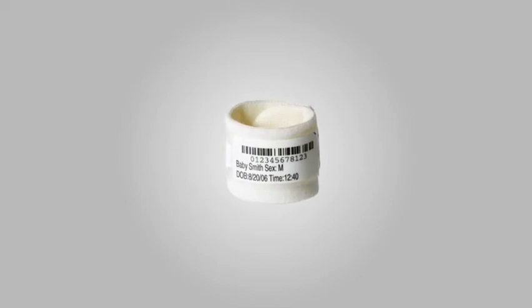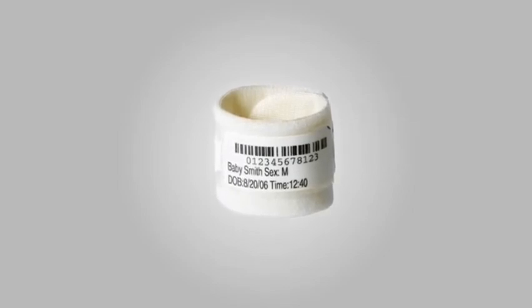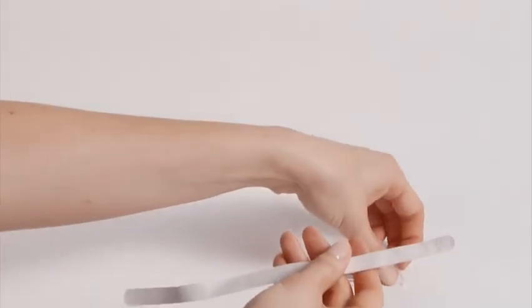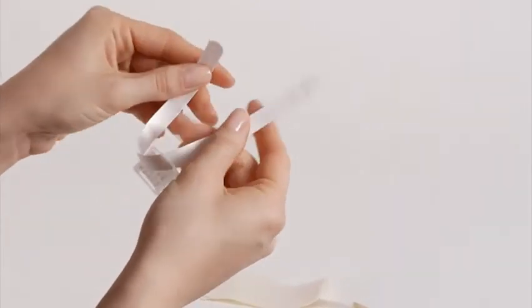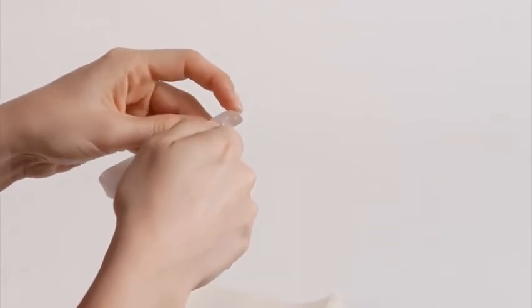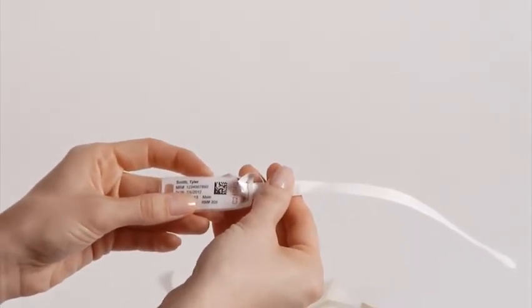Laserband's infant wristbanding solutions also include a second option using our Comfy Cuff, a soft foam cuff that adds another layer of comfort between the baby's sensitive skin and the wristband. To use the Laserband Infant ID tag with the Comfy Cuff and Swaddle Band, insert the end of the swaddle band with the largest slot through the slot on the ID tag. Loop the end of the swaddle band with the smaller slot through the large slot of the swaddle band. Pull down to tighten around the ID tag.